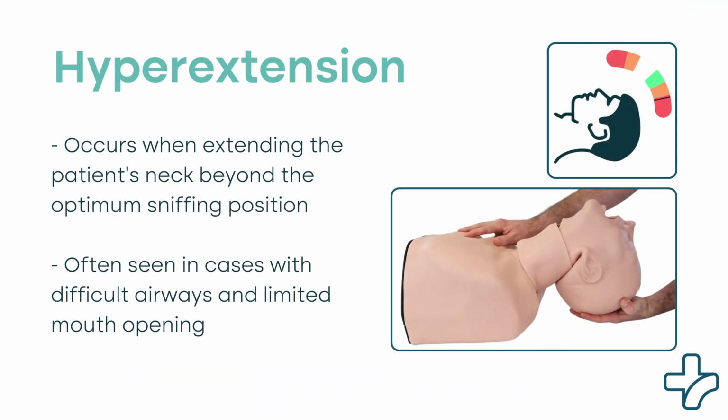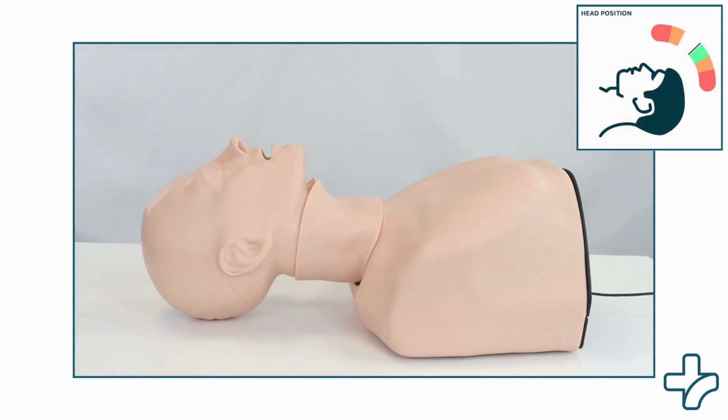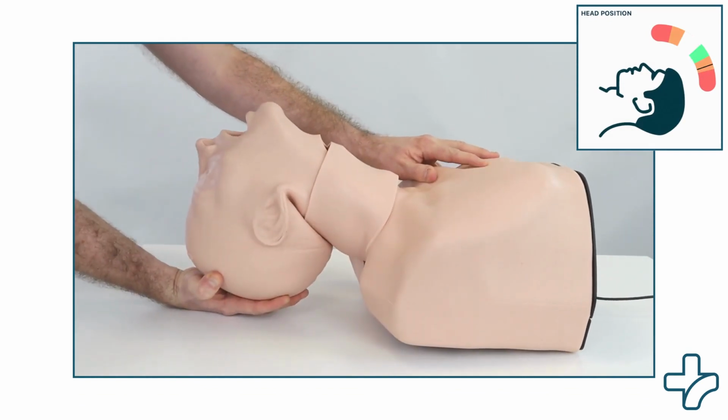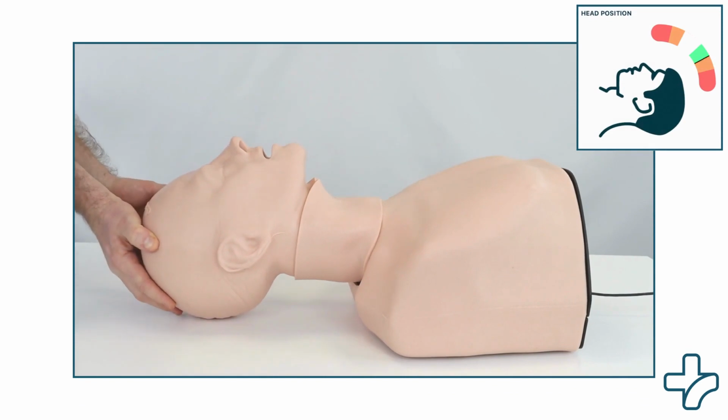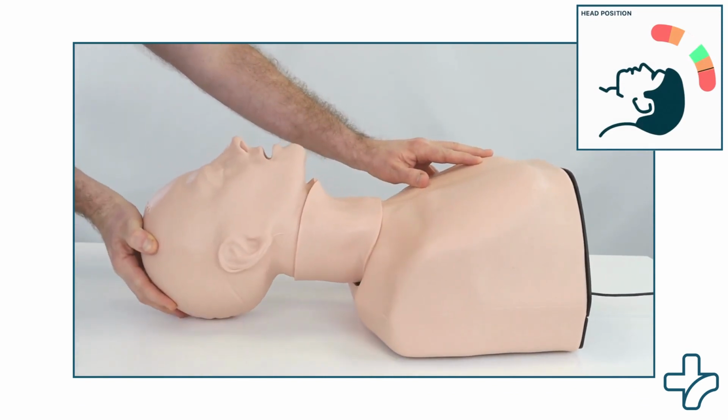Hyperextension can occur during efforts to optimize airway visualization during intubation. It can present several potential issues and risks that healthcare providers need to be aware of. Hyperextension occurs when extending the patient's neck beyond the optimum sniffing position while trying to visualize the vocal cords during intubation. This often occurs inadvertently in patients with difficult airways or limited mouth opening. Hyperextension can lead to issues such as worsening of cervical spine injury, oropharyngeal obstruction, difficult face mask ventilation, and gastric insufflation.